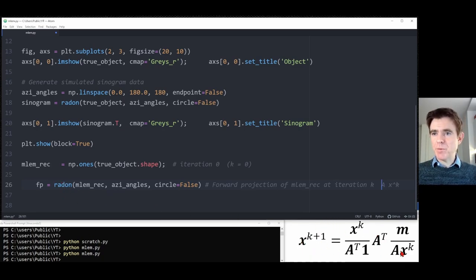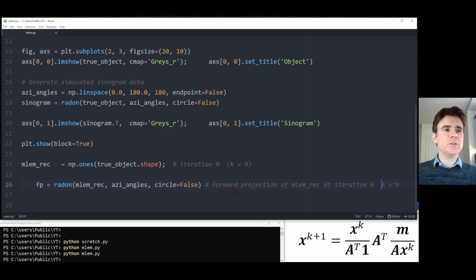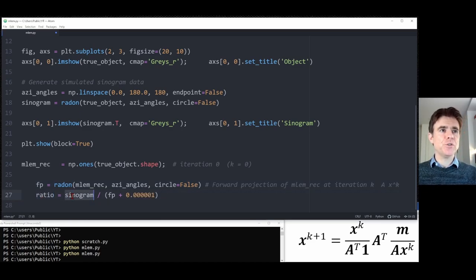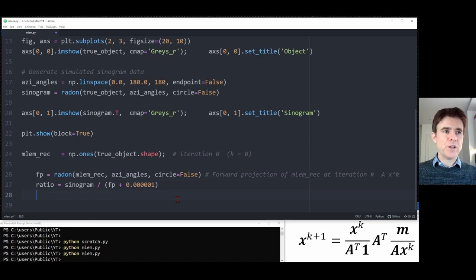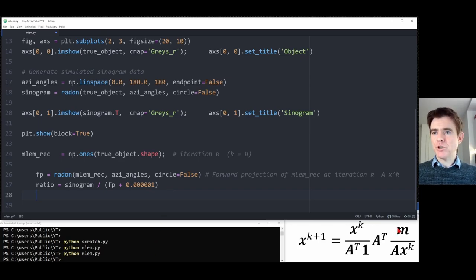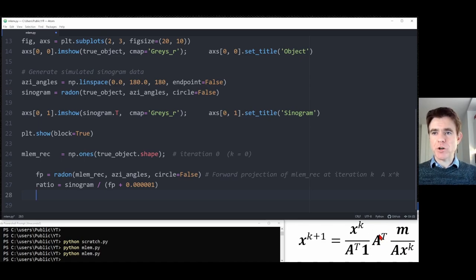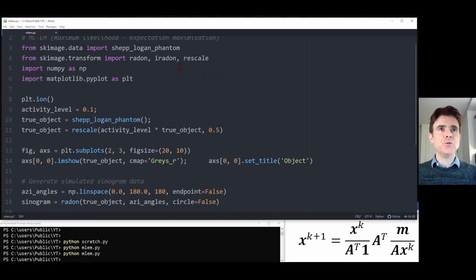We create a ratio sinogram, which is the simulated sinogram divided by our forward projection. Because we could have zeros in there, I'm adding a safety offset — this is just a demonstration. Once we have the ratio of the measured sinogram divided by the forward projection (Ax^k), we apply a transpose — the transpose of this discrete radon transform. For that we use iradon from the scikit image processing library.